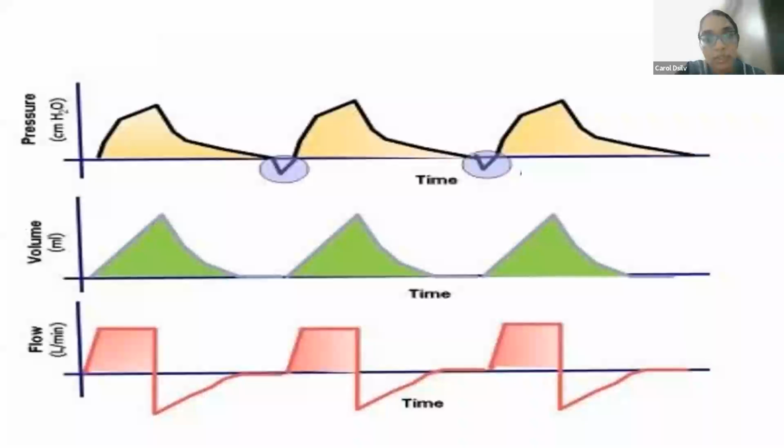Okay. So first, what is the mode of the ventilation? By now you should be familiar, so faster answers here. Volume control, assist control mode. What is the controller? Volume control, assist control. Fair enough. Great. Now what is the trigger here? What are you able to appreciate? Patient triggered. Patient trigger. But what is the type of trigger? Pressure trigger.